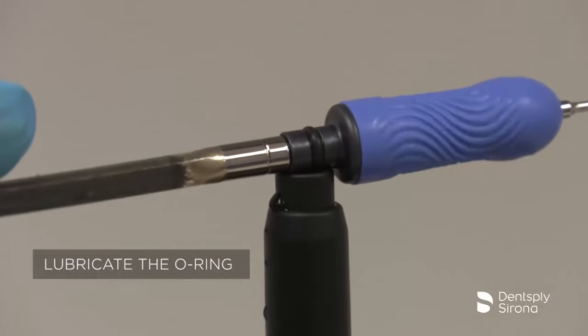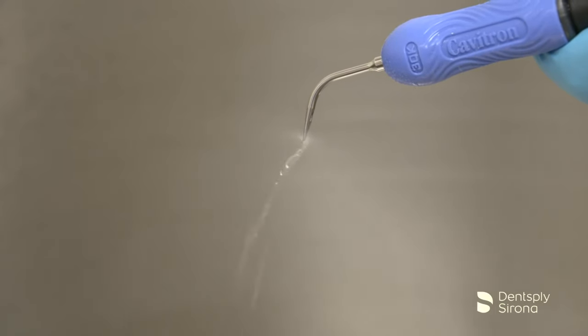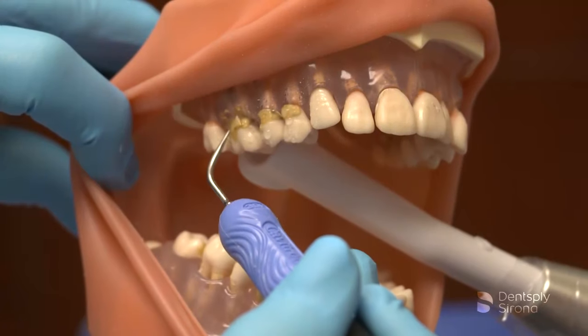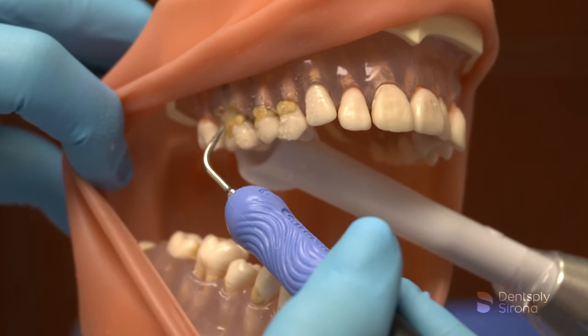After the clinician has filled the handpiece with water, seated the insert, selected the power, and adjusted the spray properly, instrumentation begins according to the treatment plan prescribed for the patient. The clinician begins by adapting the lateral surface of the Cavitron FSI-10 on the clinical crown and activates the foot pedal to begin the stroke.